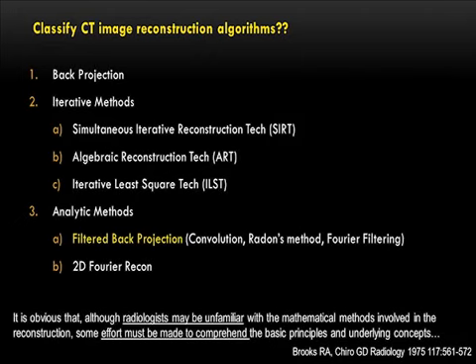Now, the toughest part of this talk was that I wanted to classify the presently available IR algorithms, and the only classification I could find in the literature was back in 1975 in the Radiology journal, which classified the CT reconstruction algorithms. If you're aware of any newer classification, I'll be more than happy to learn and discuss it with you.